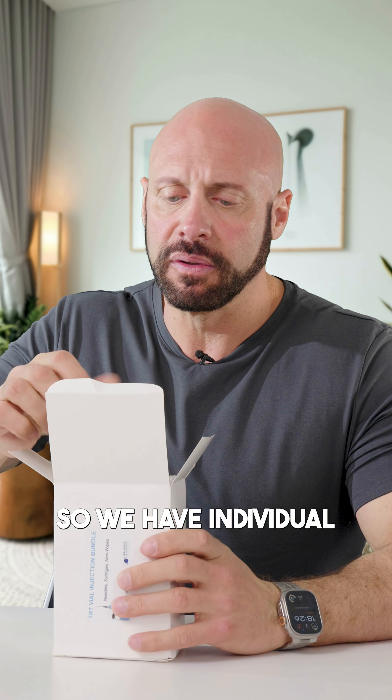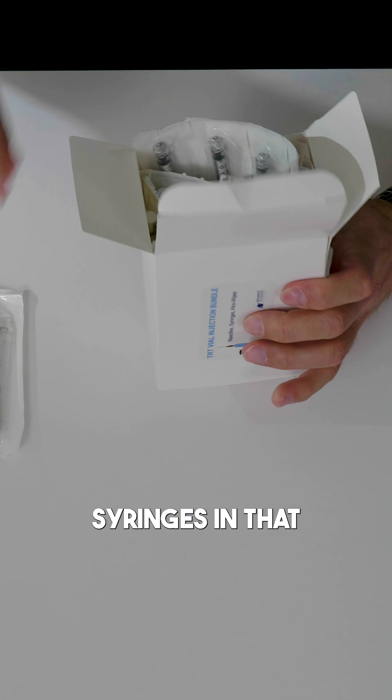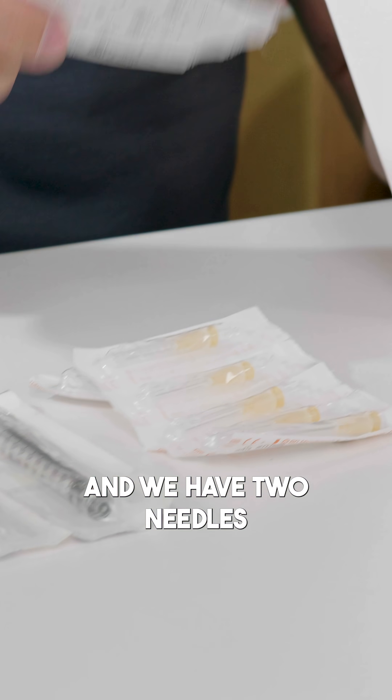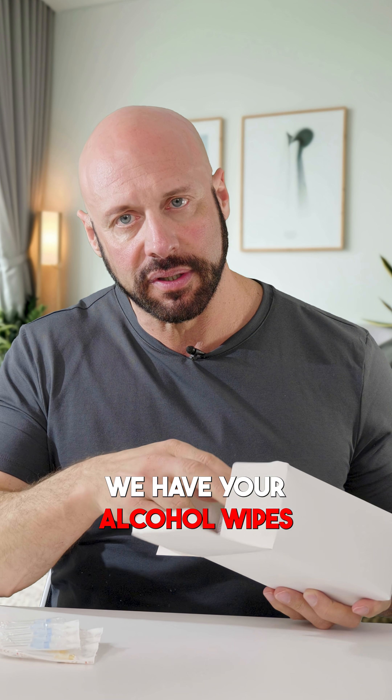We have individual syringes — quite a few syringes in there. We also have 25 gauge needles and we have blue needles. And on the other side, we have your alco wipes.